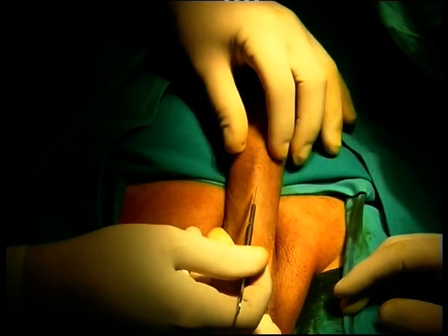The irregularity of the urethra, which can be clearly seen at both ends of the stricture, corresponds with spongiofibrosis. In the retrograde urethrography, the presence of contrast extravasation into the urethral spongy tissue and penile venous system can be seen.